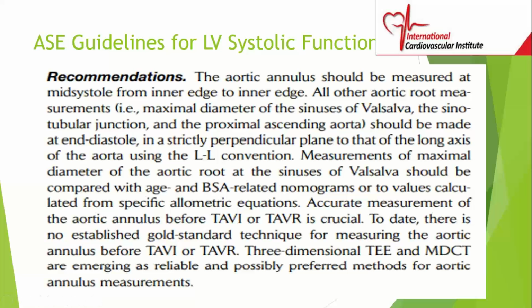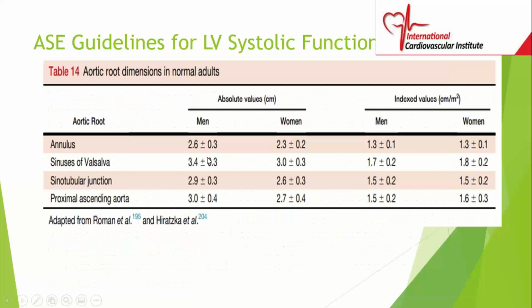Okay, so not only will you probably get this in the test, but when you're doing your studies, you should follow the guidelines. Okay, and of course, in a strictly perpendicular plane to that of the long axis of the aorta. And I'll show you again, it should be perpendicular to the long axis of the aorta.